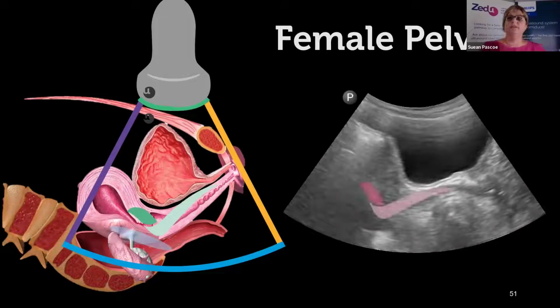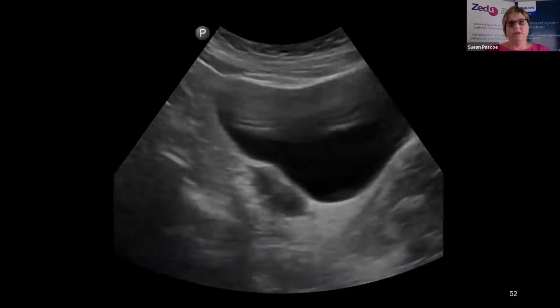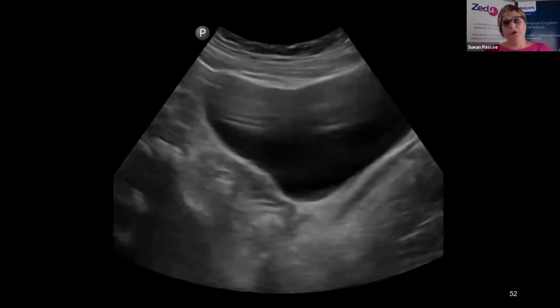So over here on the ultrasound image, we have the tick or the Nike swoosh, with the long stem of the tick there being the vagina and the short stem being the cervix. And that's like an arrow pointing to where pouch of Douglas is and where the fluid collects. We then want to make sure that we're scanning the pelvis, not just plonking the probe down in the midline and hoping that fluid accumulates in the midline.